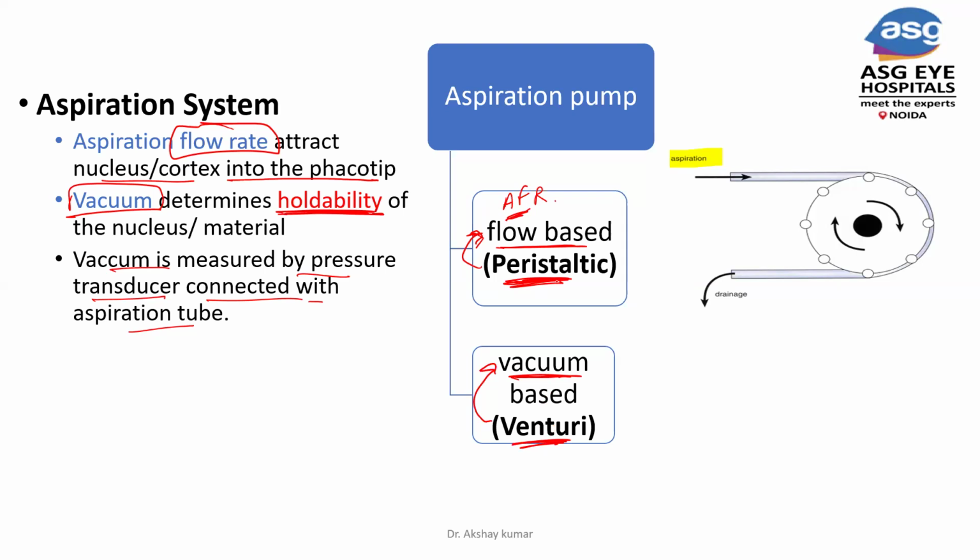In a peristaltic pump, the movement of the fluid or the water occurs in small pockets. So it is called peristaltic, like peristaltic movement in the small intestine. How does it happen? Like this. Food moves with the help of peristaltic movement itself.